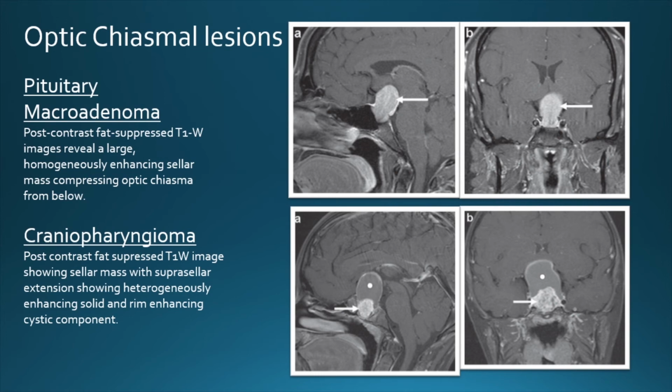So what you're showing down is a mixed solid and cystic tumor. Yes. So what is enhancing in the inferior part of the tumor is a solid component, and the rest of it is a cystic component. And then you see the rim enhancement. In craniopharyngiomas, when you suspect, you should always have a complementary CT to pick up the calcification. Necrosis is dark on T1.